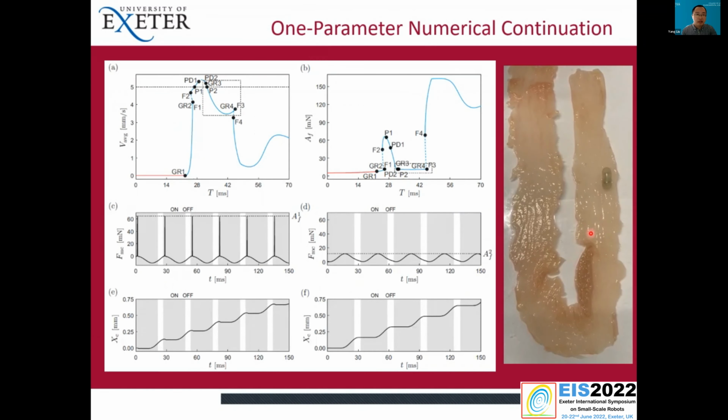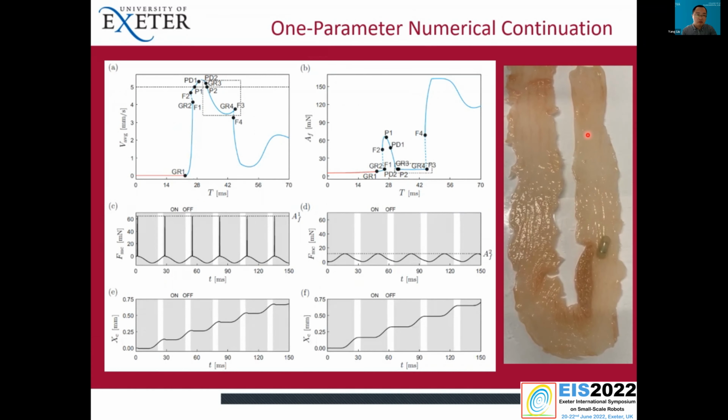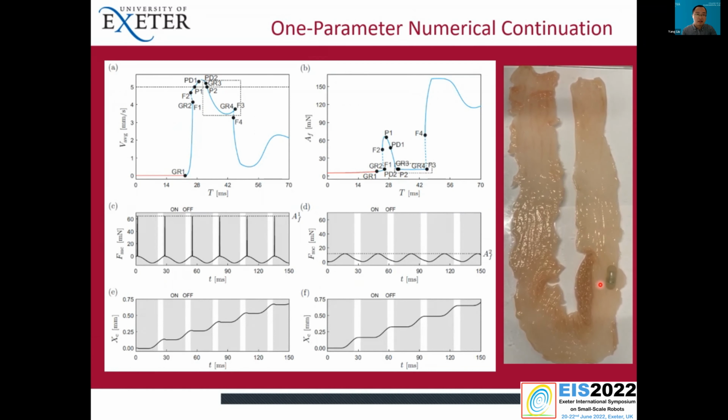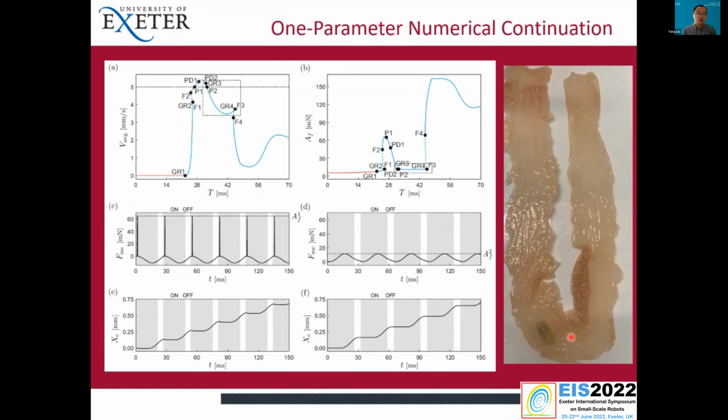As you can see, we need to drive the capsule on the small intestine smoothly, and we don't want actual impact force. When we need it, we can introduce the impact force, but when we don't want it, what we did here is optimization. We try to optimize the speed of the capsule, but also we minimize the maximum force on the capsule.